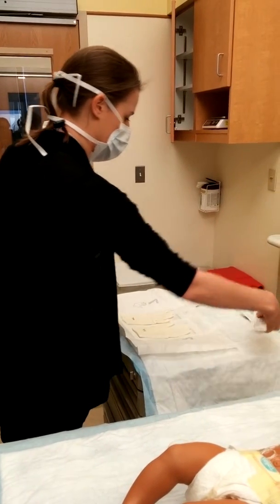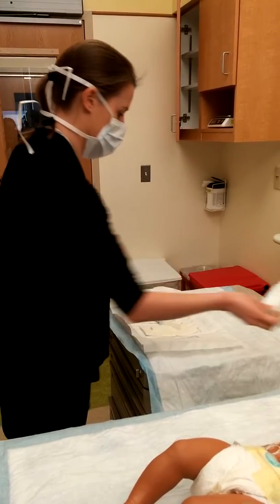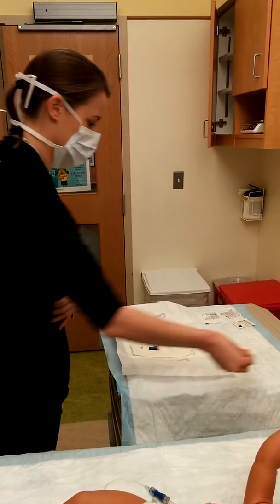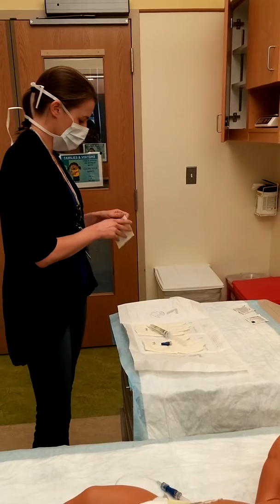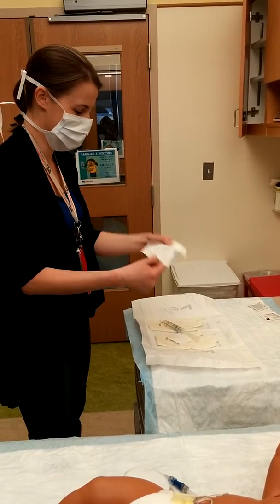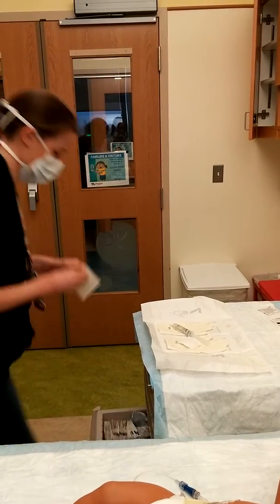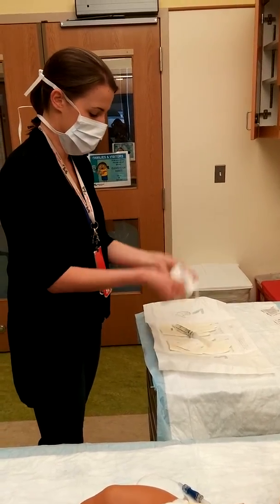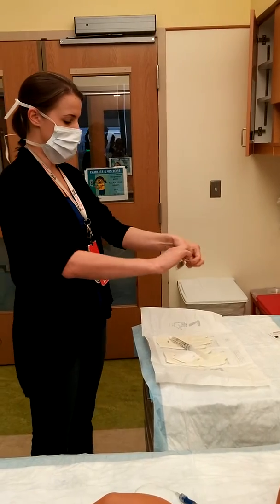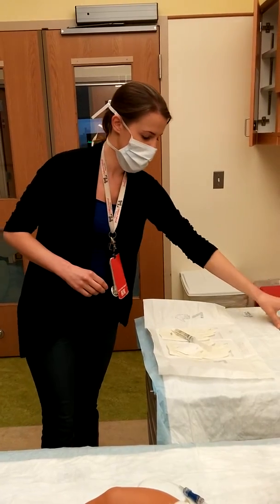Then, sterilely open all of your supplies onto your field. Sometimes things will stick and you may need one more. To open the pads, you tear once in half, and then rip again lengthwise, kind of drop, and it should drop right down onto your field.